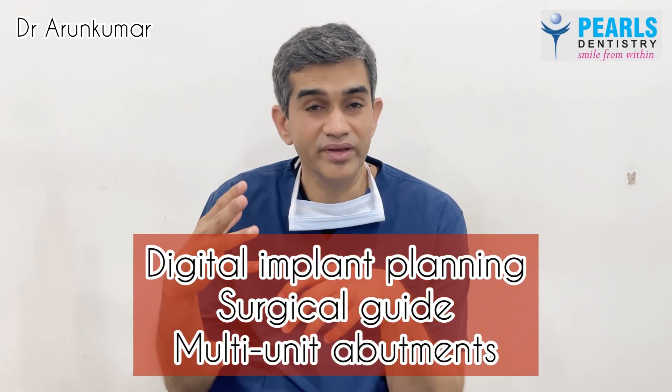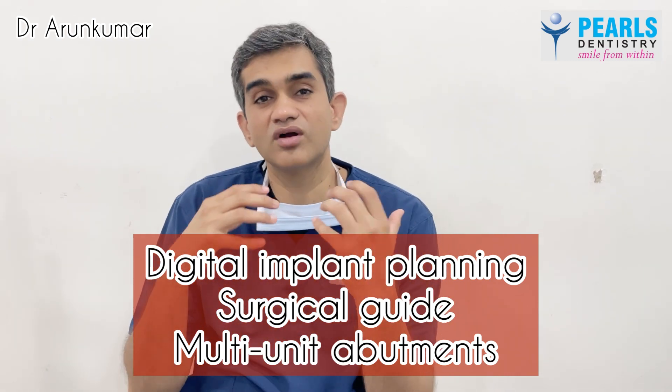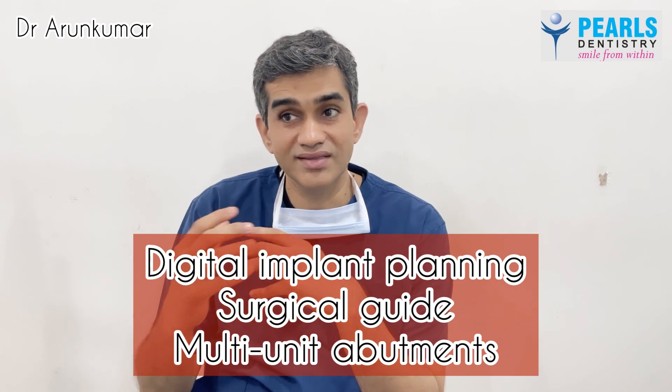In this series of videos, we are speaking about comprehensive implant treatment planning in terms of diagnosis — how we diagnose whether to do a comprehensive full arch plan, what conditions require extraction of teeth, and how to plan for the actual surgery using CBCT scan. In this particular video, we will look into the actual implant surgical aspect: how we do the surgery, whether grafting is required, what additional precautions are needed during grafting, and what abutments are and how we connect them to the implant.